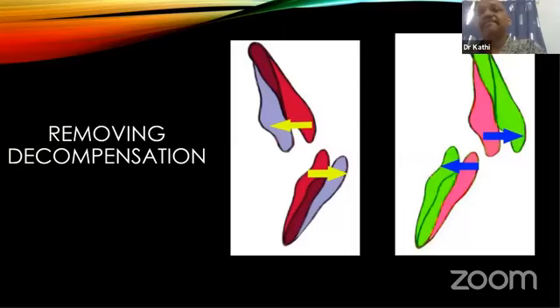This repositioning, with digital technology, we can do in the software. Once you reposition the inclination of the teeth to the normal position, then you can appreciate the skeletal discrepancy. Then you will know how much discrepancy is there. But just seeing clinically, it will be masked by the soft tissue, by the patient's expression, even by how they carry themselves, how they position the head. You can't really tell. That's why cephalometrics is really important in orthodontics, especially for a patient who is not sure whether they just need orthodontics or surgery.